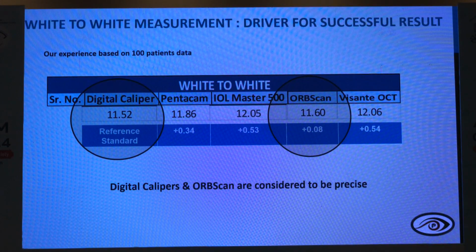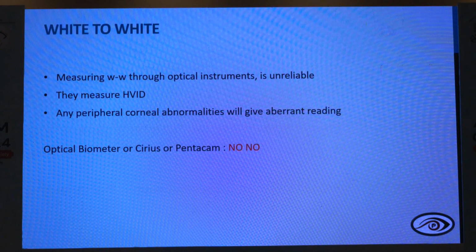Results are quite similar. But when you see with the Visante, the Visante has given a very good ACD, but coming to the white to white, it's giving an overreading. So always, what we do normally, under the microscope, we take them to the OT and we do it.